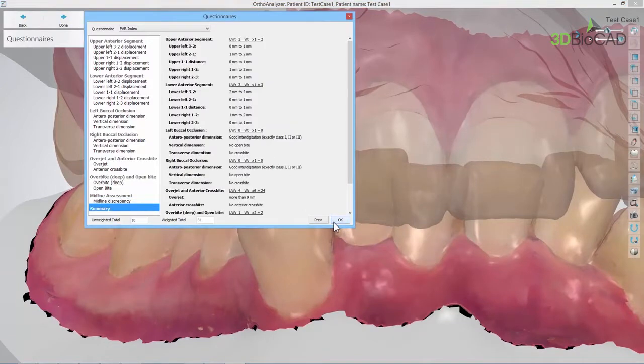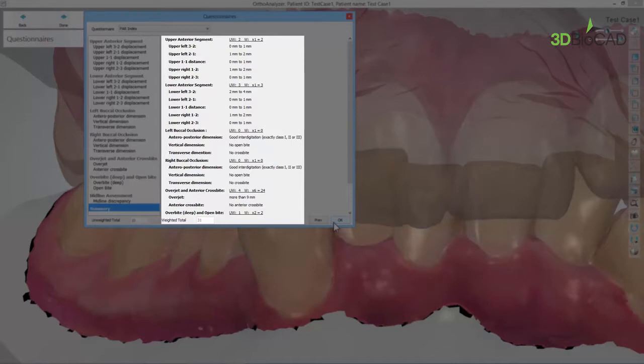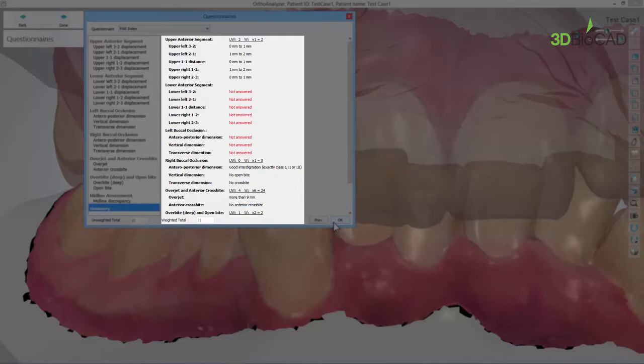At the end of the analysis process, you'll see the summary. It consists of all the steps involved in the PAR index scoring. Any unanswered steps will be correspondingly marked in red, so you can go back to them and complete if needed.